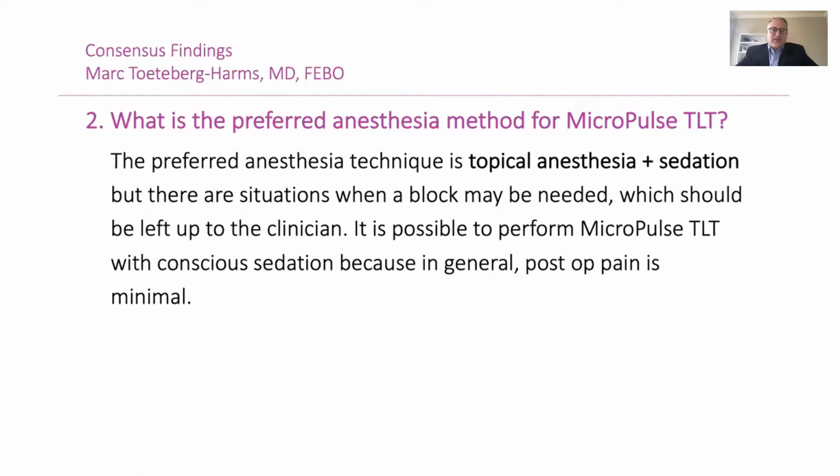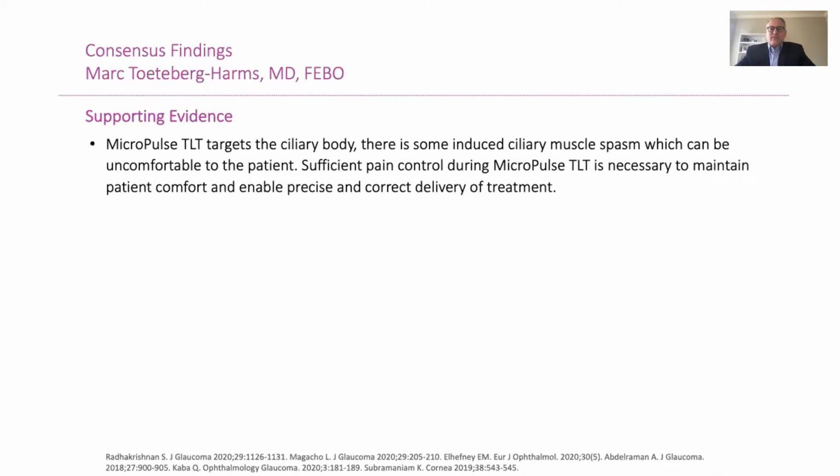And in general, it is possible to perform MicroPulse TLT in conscious sedation because post-op pain is usually very minimal. To support these answers, you still target the ciliary body, and there may be some induced ciliary muscle spasms, which can cause some uncomfortable feelings and some pain for the patient. So sufficient pain control during the procedure is necessary, to maintain patient comfort, but also to enable the clinician a precise and correct delivery of the treatment.